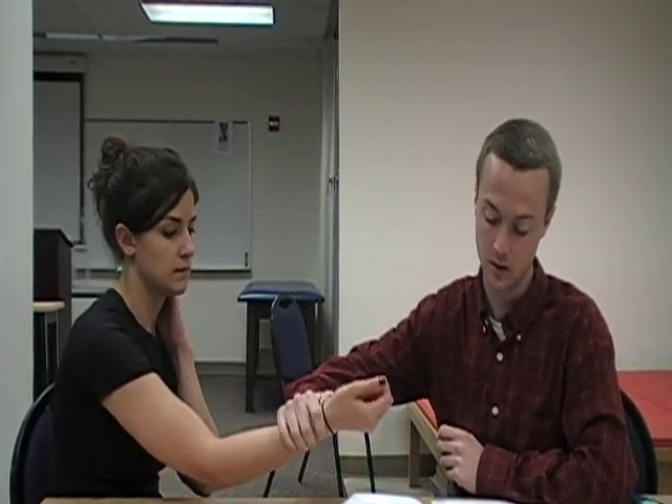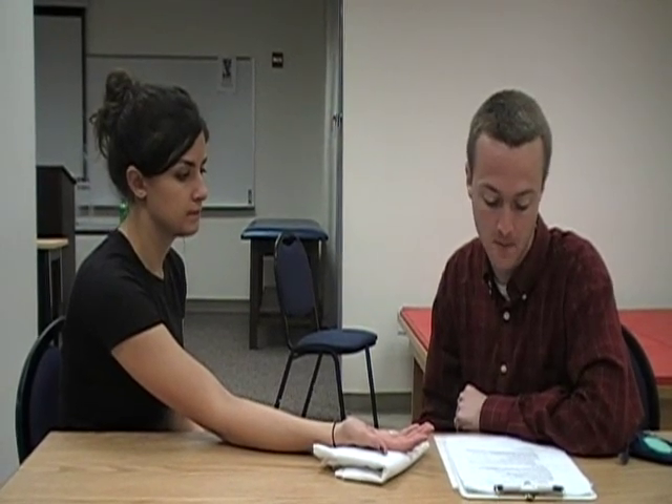We will instruct the client to lay their hand in a comfortable position. You do not want to touch the client because it might interfere with the test. You want to support the hand of the client on the table, and you will ask the client to either look away or close their eyes.